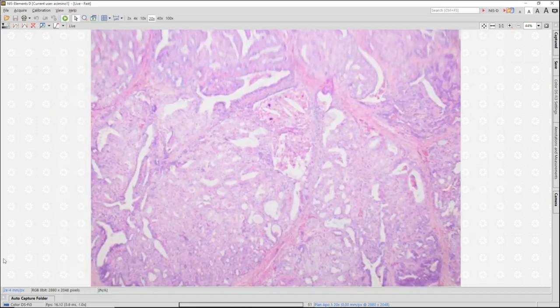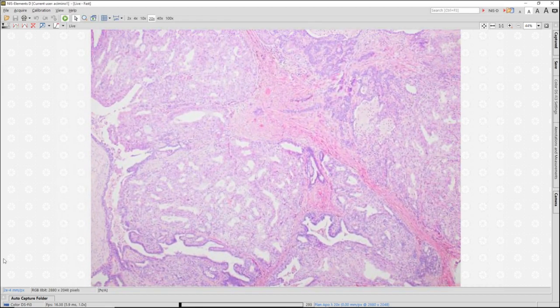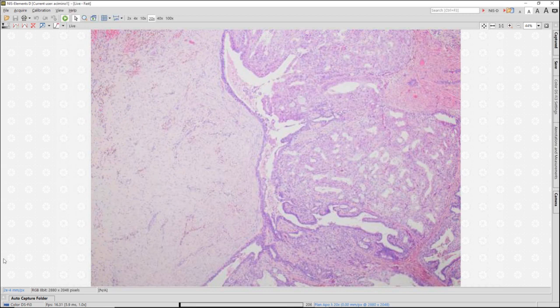And we'll take a look at this papillary lesion here. Okay, so here I have a papillary lesion on excision. It's kind of a lot of light. Let me pull it down for you. Here we go. Where I have to say, okay, what am I dealing with? I see that I have a fairly smooth contour to the lesion and a dilated duct space with this lesion within it.